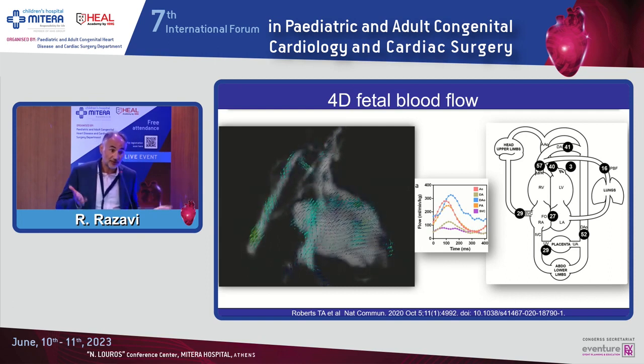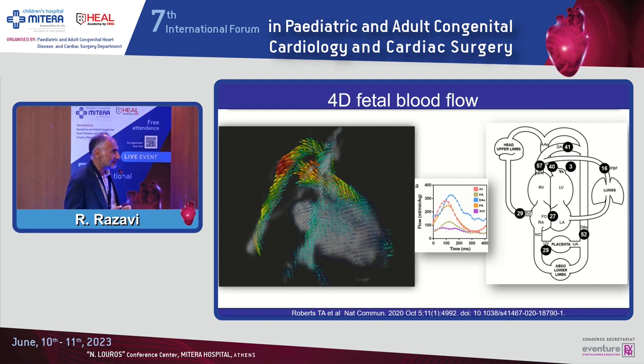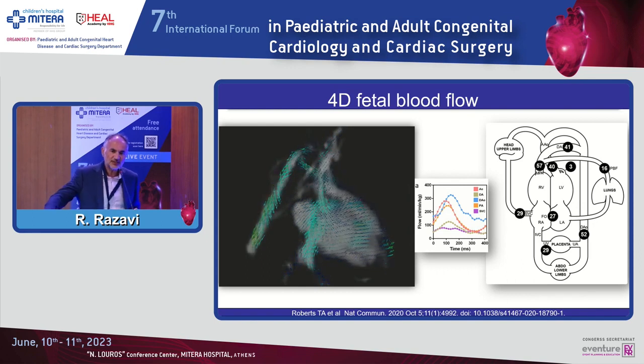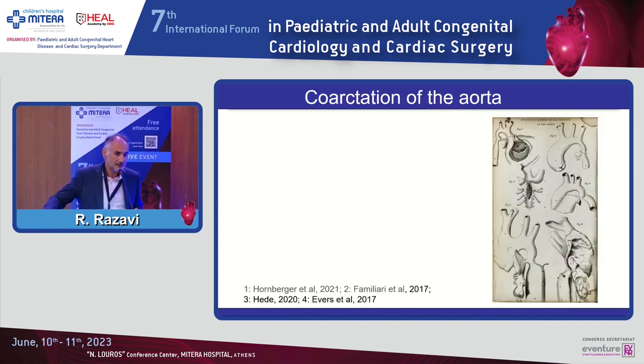We have now a thriving clinical service, actually delivered by Kibiran and another one of my ex-PhD students, David Lloyd. And you can not only get the anatomical information, but flow on the different vessels. And you might say, well, how is that important? Well, let's take a really difficult, thorny problem for fetal cardiologists. For the fetal cardiologists in the audience, how good are you at diagnosing coarctation?